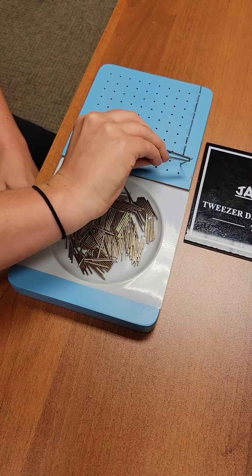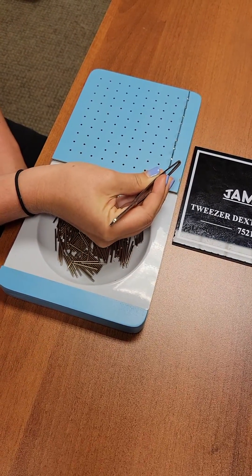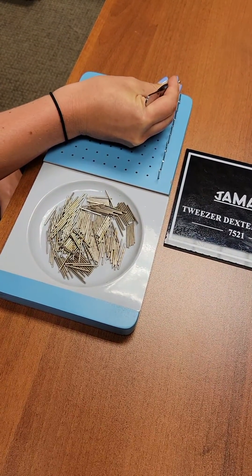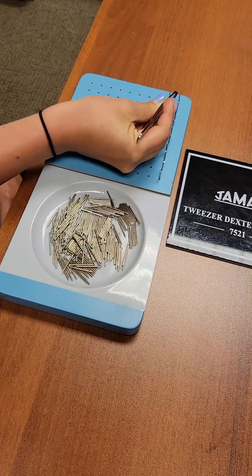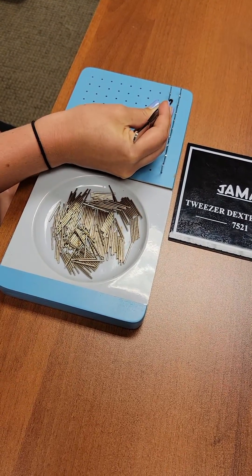You can see that Andrea is working with her right hand going from left to right, and the next row would also be left to right. You always start in that far corner and work down to the bottom right corner. If you're going to do the left hand as well, you would flip it around so that the bin of pins is on the left side.